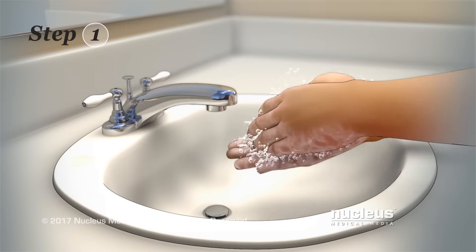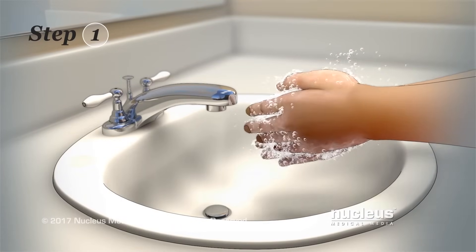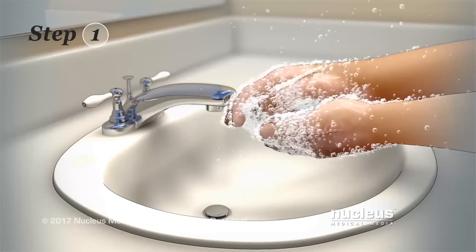Step 1. Before you begin, wash your hands with soap and water and then dry them.